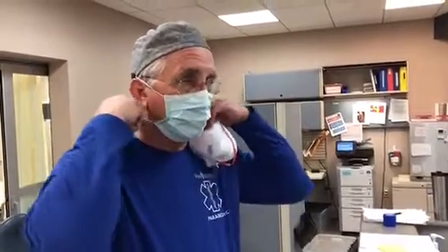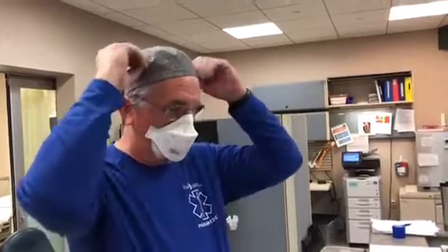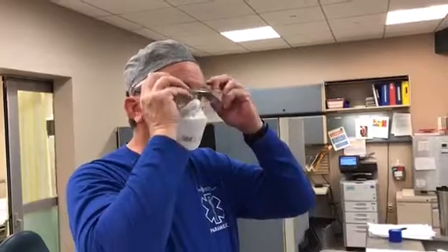The assistant person will put on eye protection, and they will change out their regular surgical mask for an N95 mask. They'll make sure it covers their nose and mouth and pinch it off really good. Take a deep breath in and out to make sure there's no air coming, and then they will put on their eye protection.